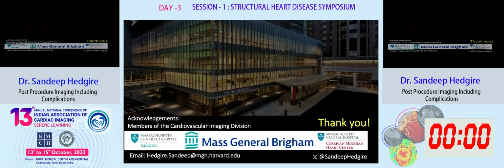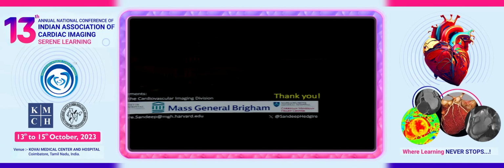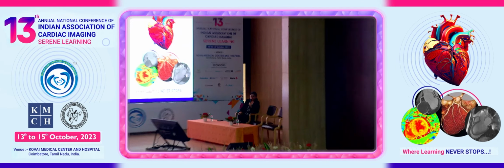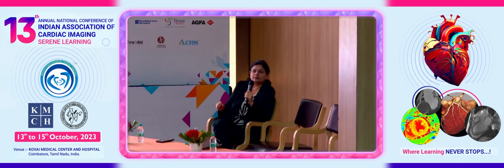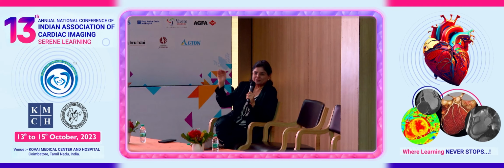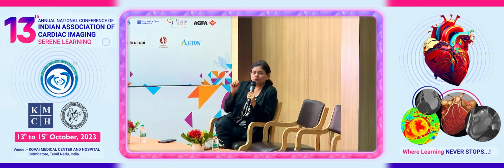Thanks, Sandeep. Brilliant talk. I want to put these two talks together. When you talked about the heart team, you said the cardiovascular imager, the interventionalist, and the surgeon and whatever else. What you missed out was the radiologist who reads the CT. The fibromuscular dysplasia, as showcased in Sandeep's talk, will never be picked up by somebody who's not reading it.